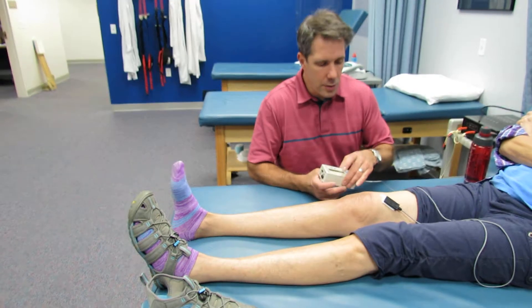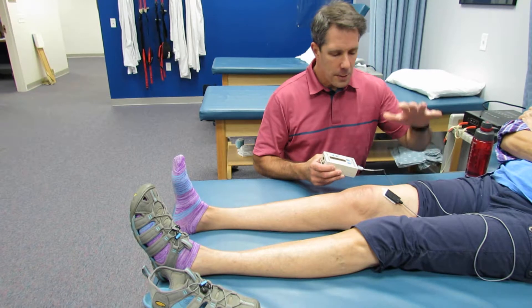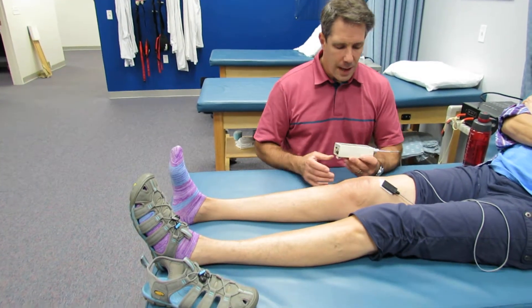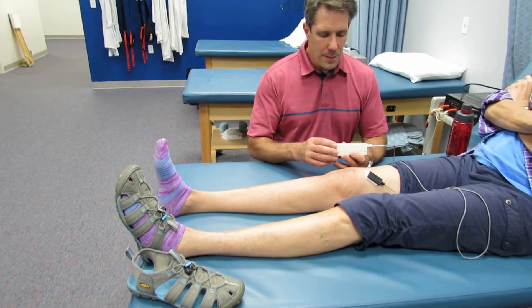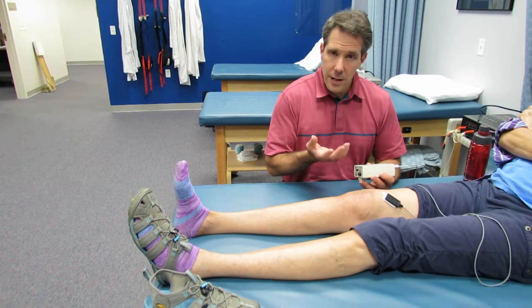So what we're going to do is we have her hooked up — we have biofeedback on the VMO — and we're going to ask her to tighten up that quad, push her knee down into the table. She is getting probably like two microvolts, which really isn't a lot, so in order for us to get her to activate a little bit more, we're going to give her something to push against.